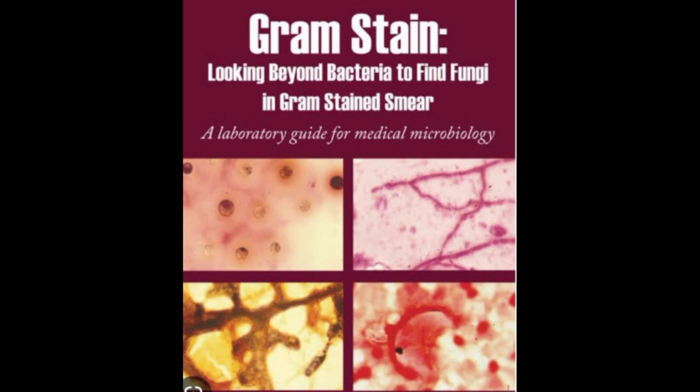Primary samples: urine, sputum, throat swab, aspirates from different sites of catheter, swabs from different sites, pus, CSF and other body fluids. Tissue: bone marrow, biopsy materials, endometrium and surgical tissue, semen. Type of containers and additives.